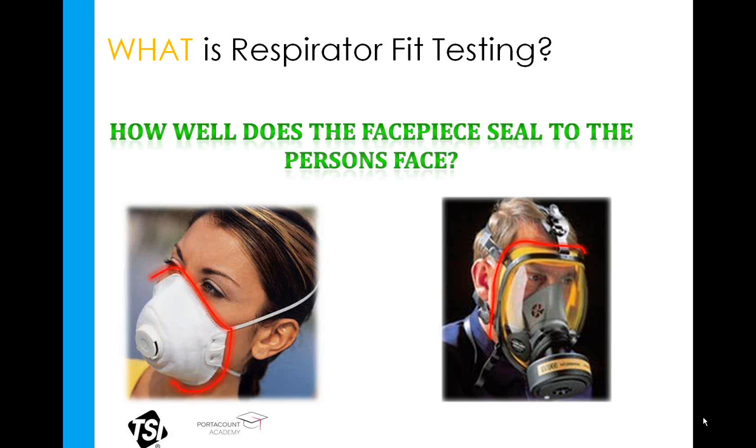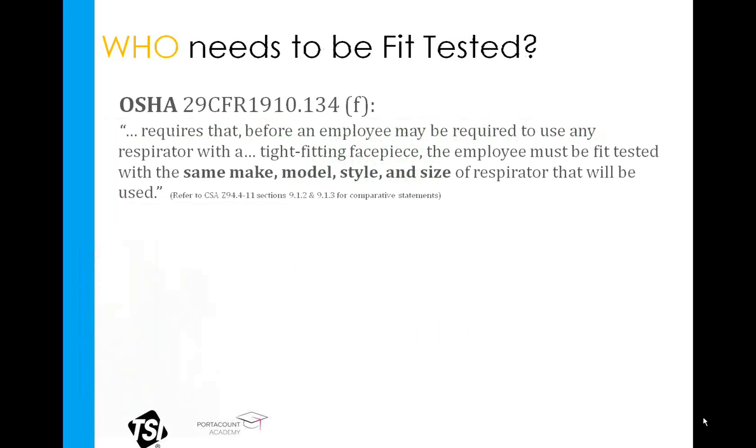It is not a test of the integrity of the respirator or the filter. It is quite literally testing how well the respirator seals to the face, specifically where it comes in contact with the skin to create a seal, outlined here in red. Could a passing fit test be viewed as evidence of the mask's good integrity? To a point, yes. However, a failed fit test does not in the same way assume a poor integrity of the mask, as a failed fit test could obviously be derived from a poor fit instead.